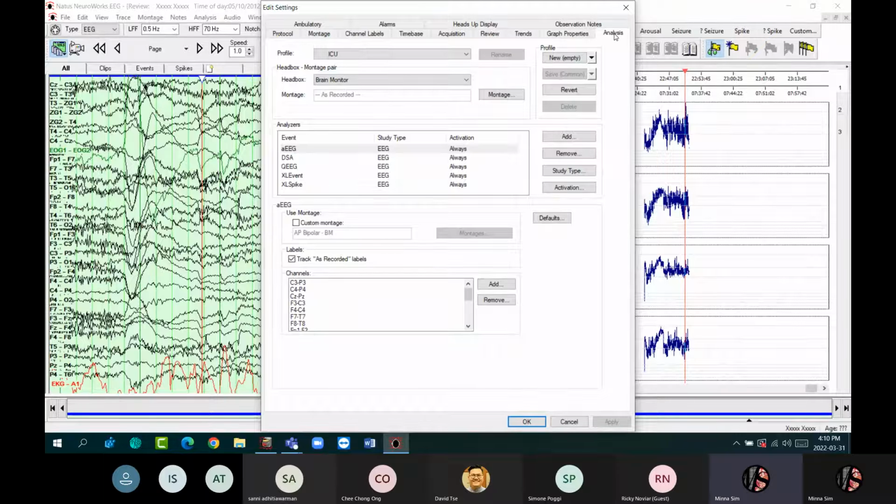Any other questions? If you don't have questions right now, it's okay. You can always email me and I will try to help you over email. I think we can just continue for now. We have actually finished all the advanced training already. I have shown you the online configuration and offline configuration. It's actually the same thing, you are just in review mode or acquiring mode. And I also showed you the ICU touchscreen mode as well.